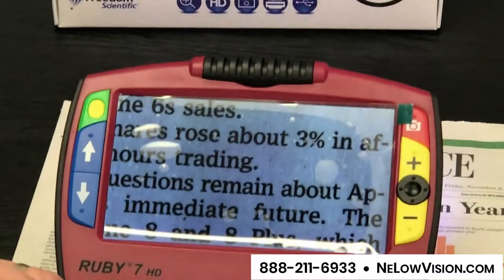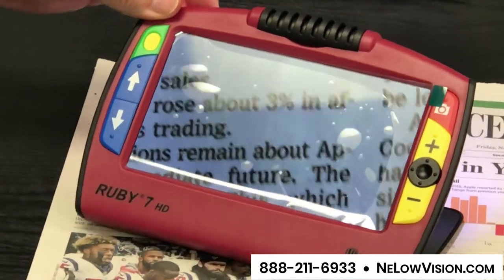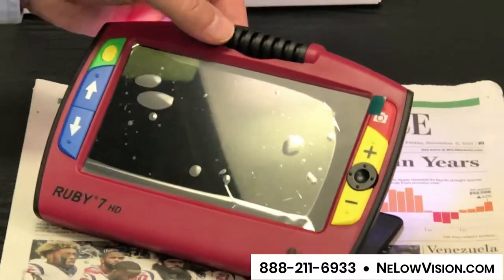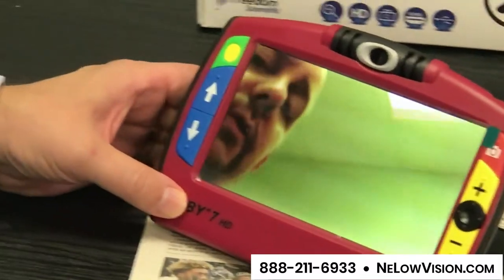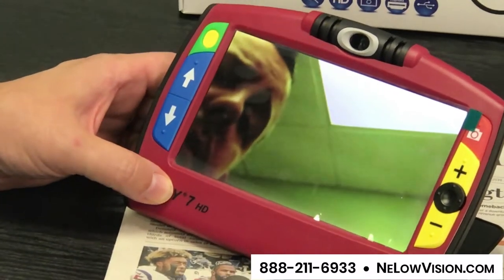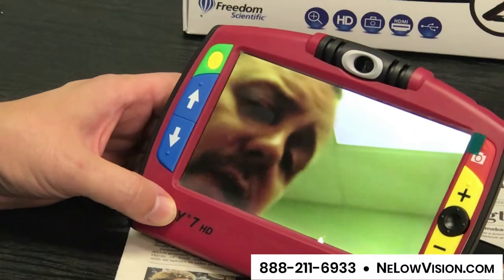One of the nice features of this device is that it has a camera that can be twisted. I'm going to twist this camera back for self-viewing mode, and now I will appear on screen. That might be helpful for ladies to apply makeup, for gentlemen for electric shaving, or any number of uses.